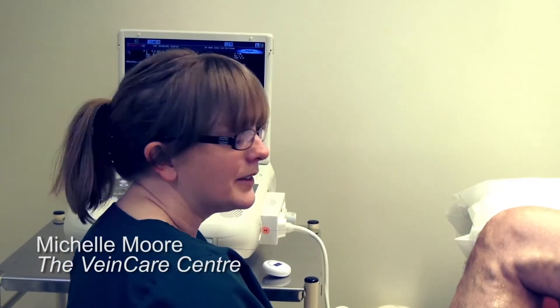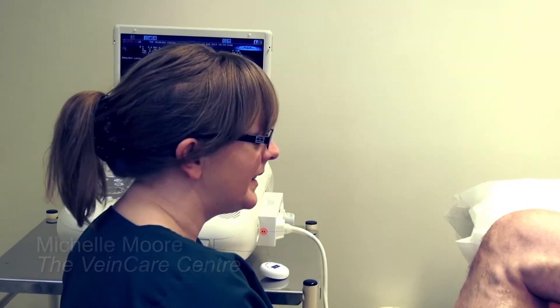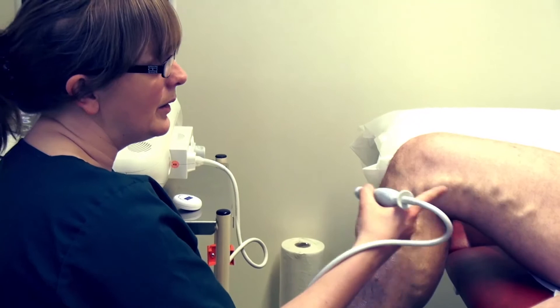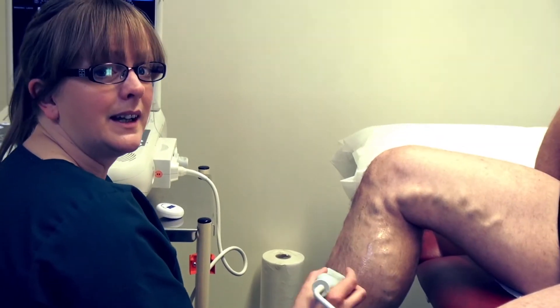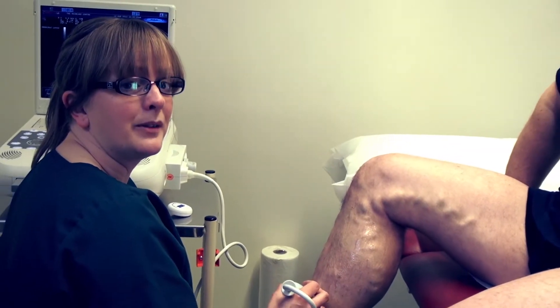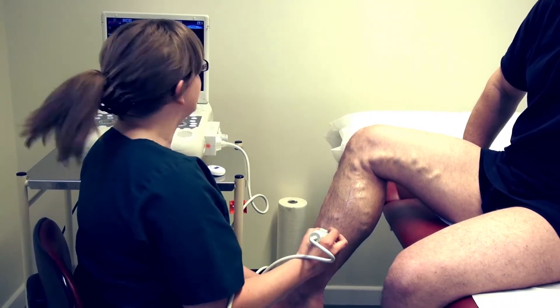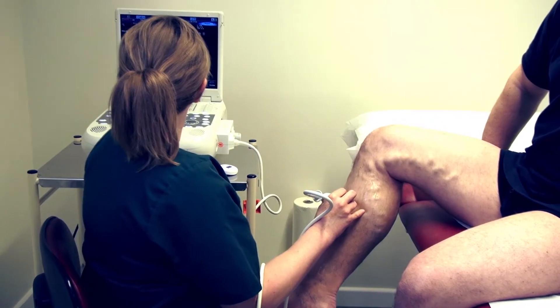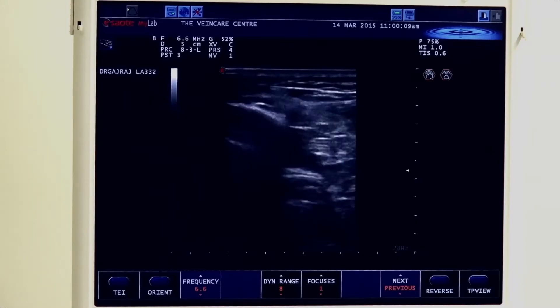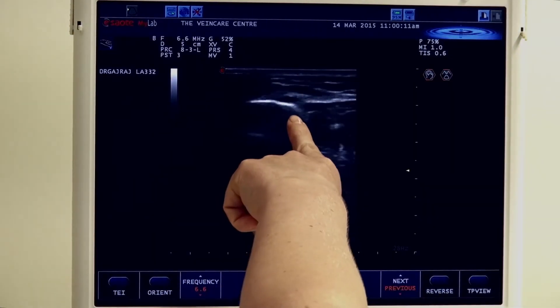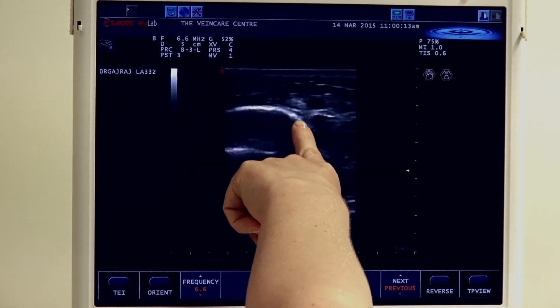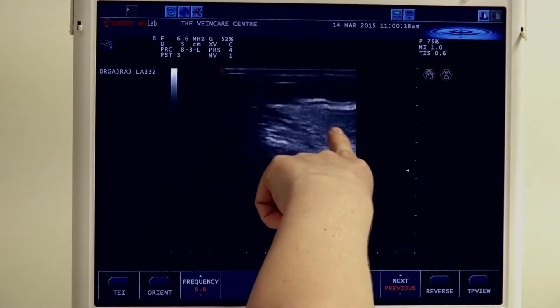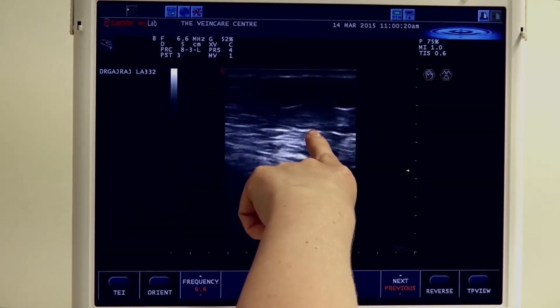We're going to now have a look at the calf to assess for any calf perforators. Occasionally you'll find no incompetence of the long saphenous nor short saphenous vein and there may well be just a single calf perforator leading to troublesome varicose veins. So we're going to start out in transverse position. Here we can see the tibia bone and the fascia between the deep and superficial planes. This is our distal long saphenous vein which is relatively normal in size.